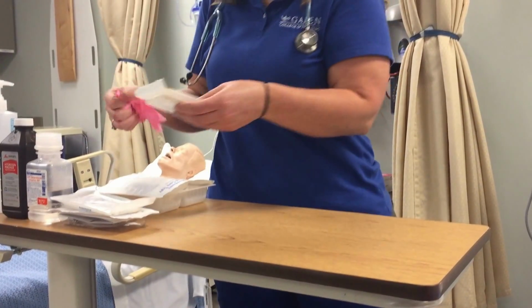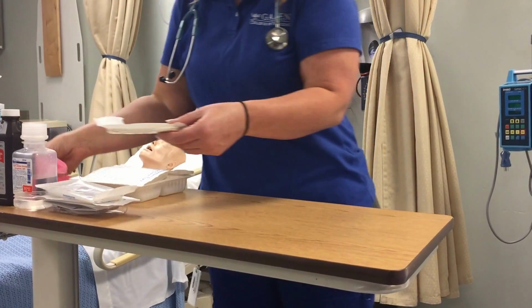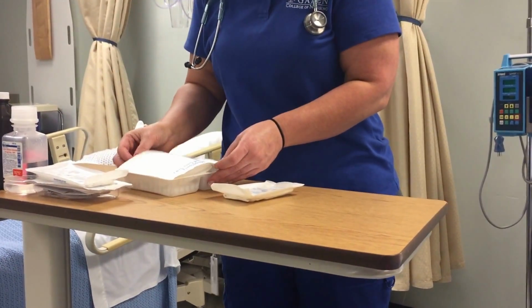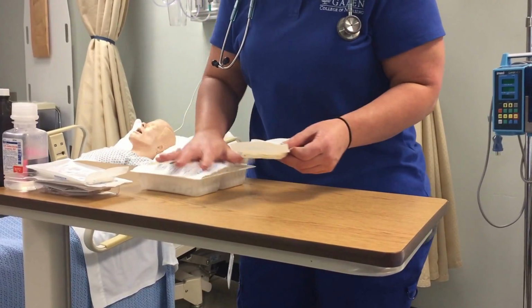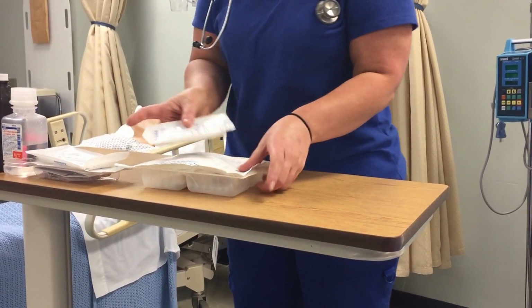extra set of gloves if I should need that, if they're not accessible or handy in the room. Another set of sterile gloves if they're not included in my trach kit, but sometimes they are, but having an extra set's not handy. And then also my trach care kit.